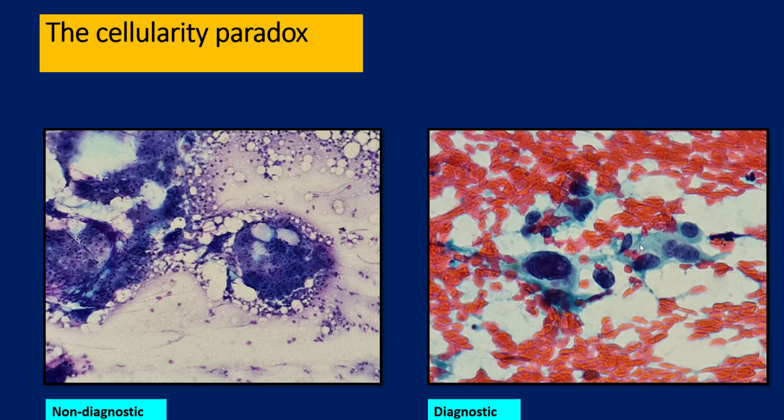However, in this case, you have just a few cells. Just in one corner of a smear, you maybe have around 7 or 8 cells, but looking extremely pleomorphic. Turned out to be, by the way, a salivary duct carcinoma. This is diagnostic, right? So that's why using cellularity is no use unless and until you are correlating it. And once you correlate, I don't think that 60 cell counts, which is being proposed by many experts. I really don't believe in that.